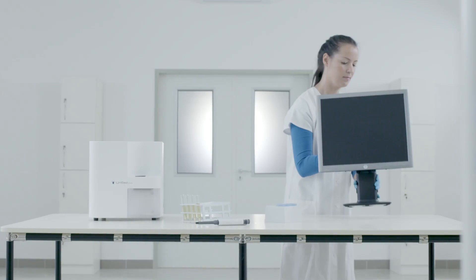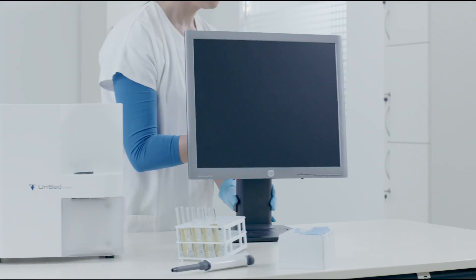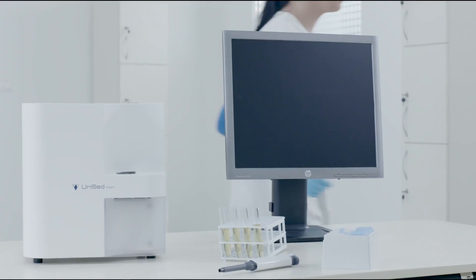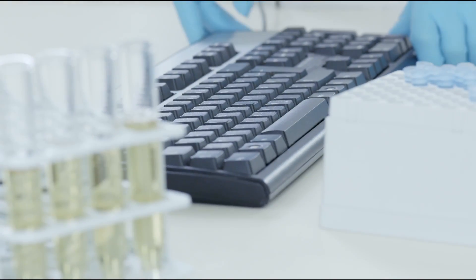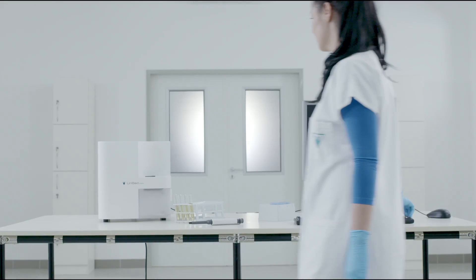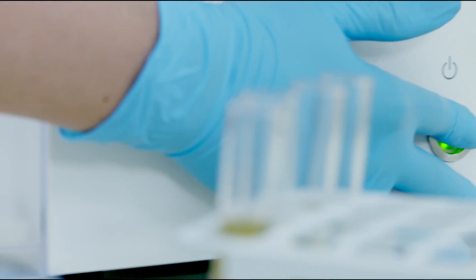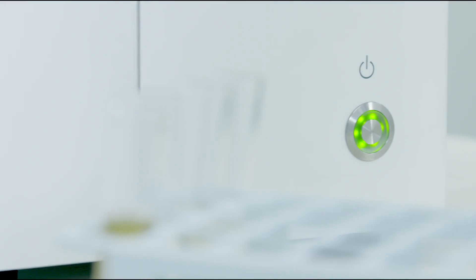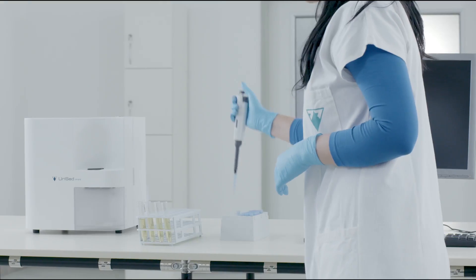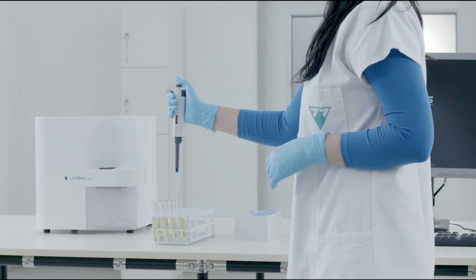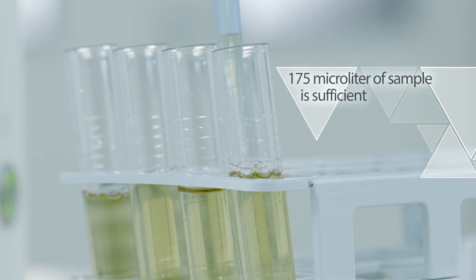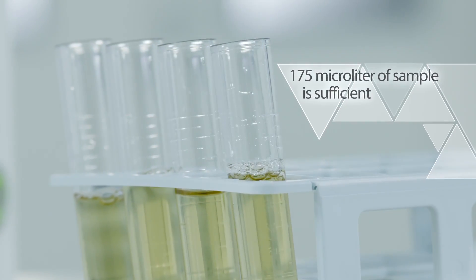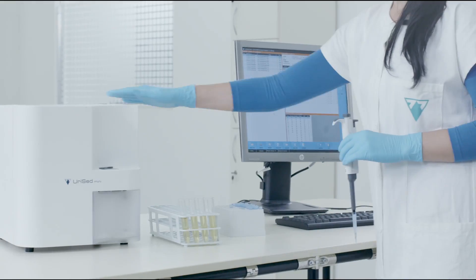URISED Mini is easy to use, and with a built-in PC, needs only a keyboard and an external monitor attached to display the results. 175 µL of homogenized sample should be injected into the cuvette by the operator.